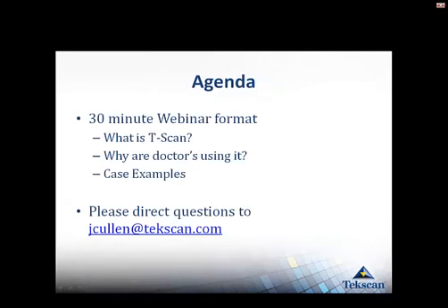Our agenda for the evening is a 30-minute webinar format. What we're going to discuss is really what TScan is, why our doctors are using it, and then we're going to spend a good amount of our time going through case examples, because I think that's the most important.